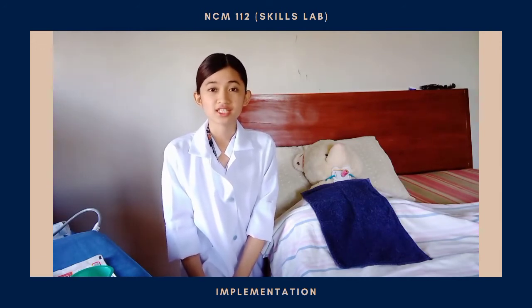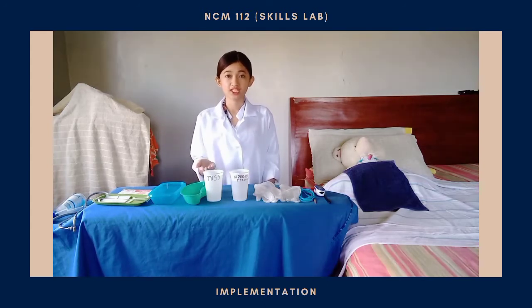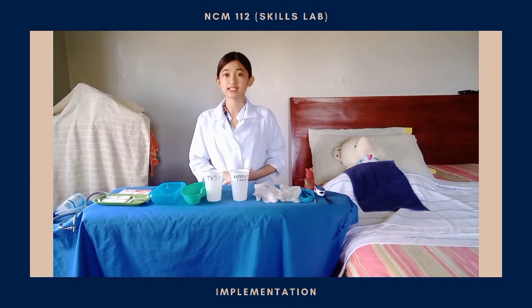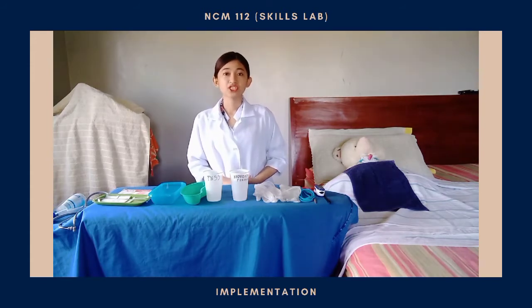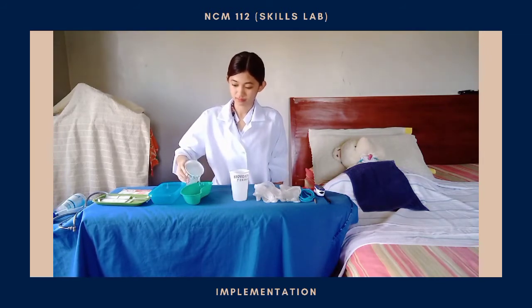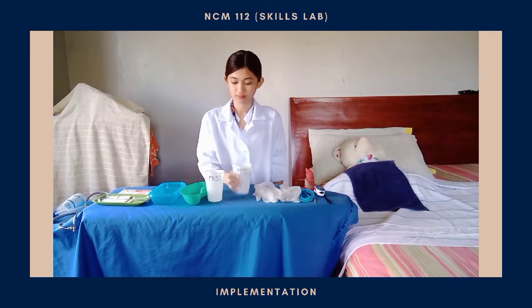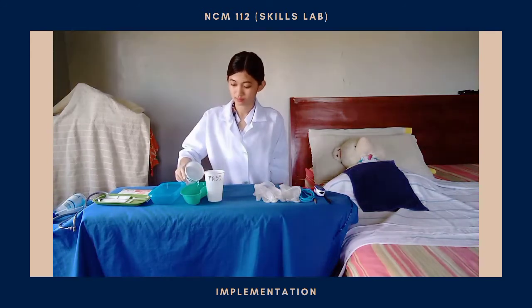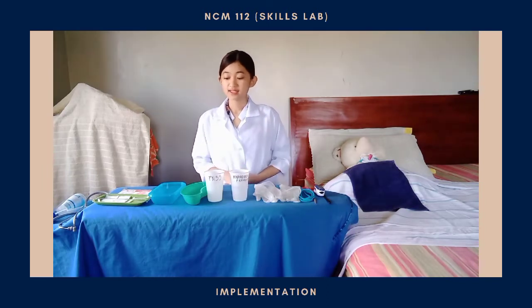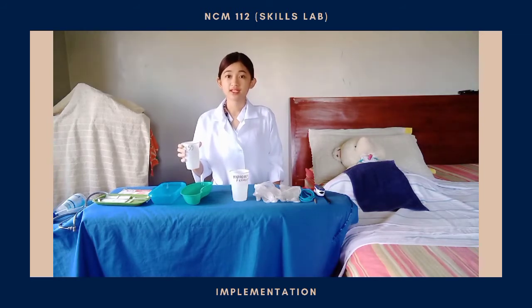If the tracheostomy has just been suctioned, remove the soiled side dressing and discard before removal of gloves used to perform the suctioning. Prepare the basin and cleaning solutions. Mix the plain normal saline solution and the hydrogen peroxide in one basin in a ratio of 50-50, and be sure it will fill 0.5 inch of the basin. Pour plain normal saline solution in the other basin and be sure that it will fill at least 1/2 inch.